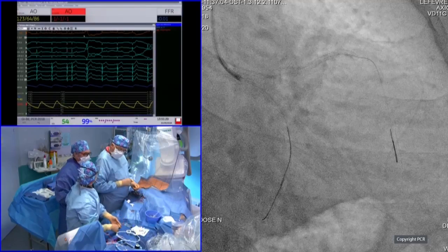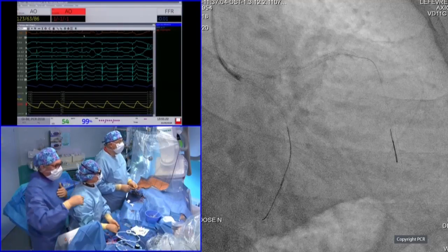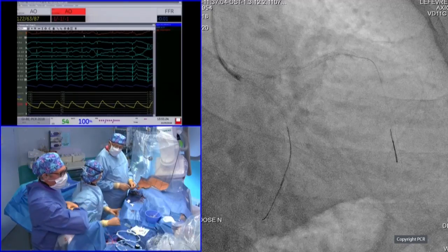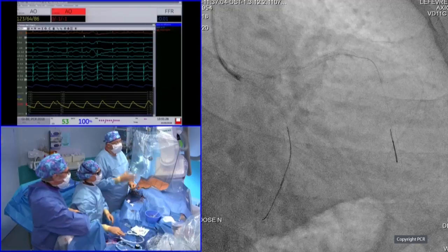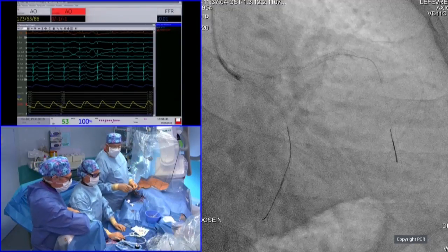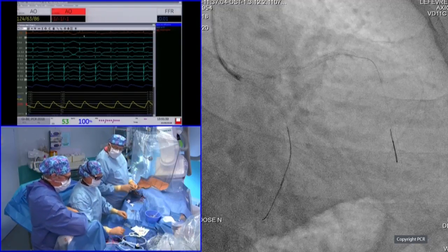Do OFDI now and check the position of the crossing. I think it's a very nice demonstration. In my opinion, we are not in a distal strut, but okay, we can do it. We need to know where the struts are exactly if we want to check. We go to the OFDI.